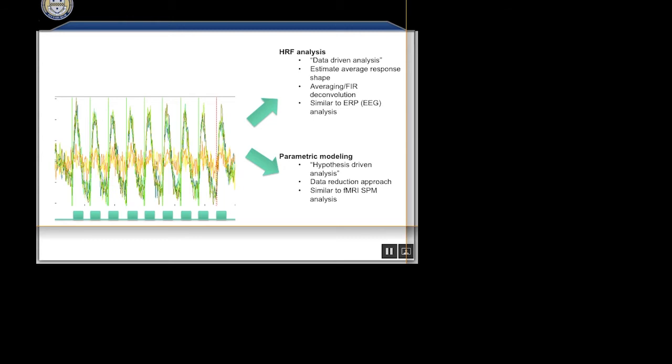So there's really two different schools of thought, let's call them, on the analysis here. Historically it came from where people coming into NIRS had their background. In the NIRS community, historically we drew a lot of users, and I know this from this crowd here even, that either came from having done previously fMRI experiments or EEG experiments. And the EEG people, which a lot of the pediatric type imaging people that migrated into the NIRS field came from that EEG type world.